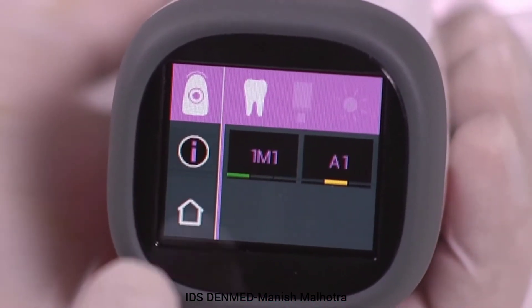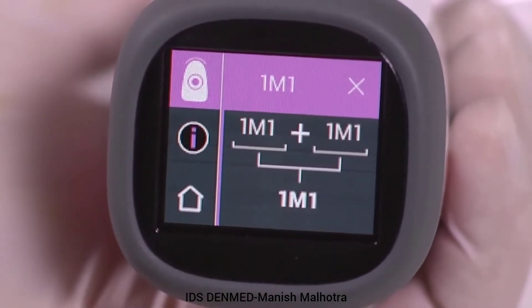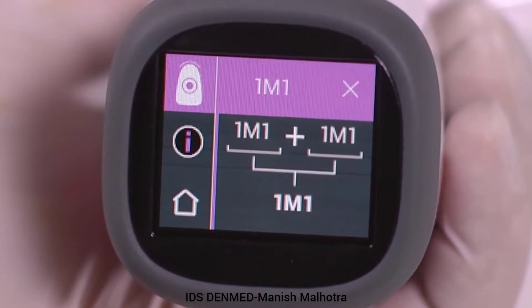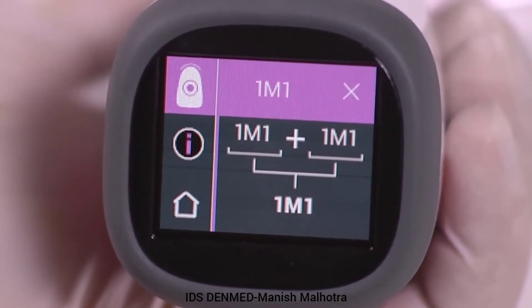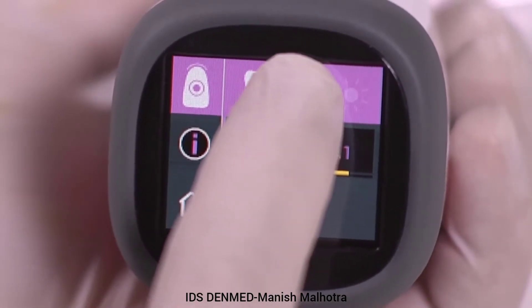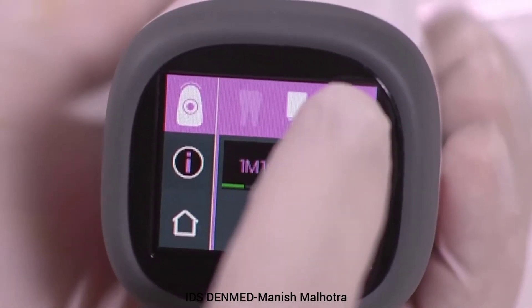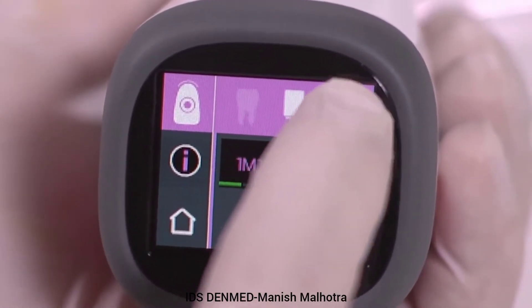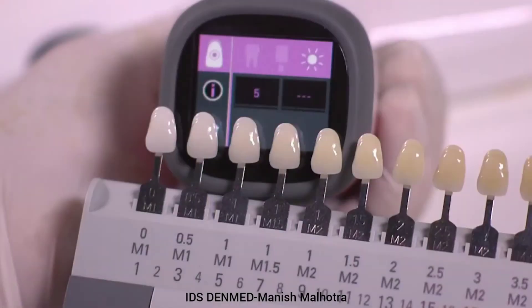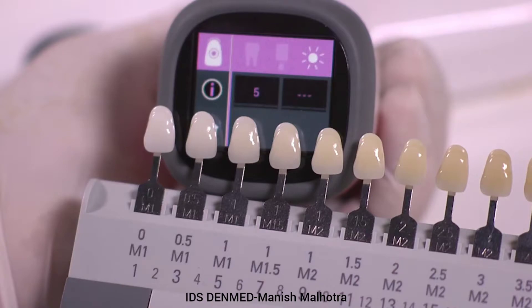Touch the displayed shade color bar to see additional shade information. For Vita 3D Master, additional information provided may be a closer interpolated shade or in-between shade. Select the block icon to display the closest approximate Vita machinable block shade. Select the sunburst icon to display the bleach index number, which can be used to communicate tooth whitening progress. Communication with the patient can now be facilitated with the use of the Vita bleach guide for patient visual acceptance of tooth whitening.